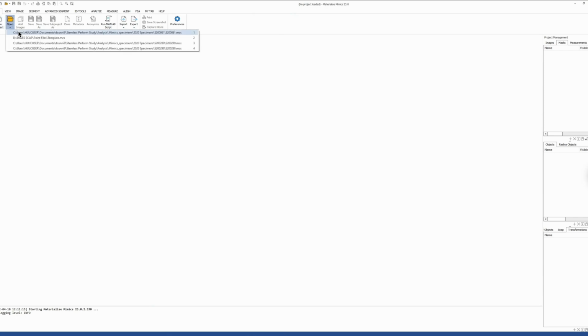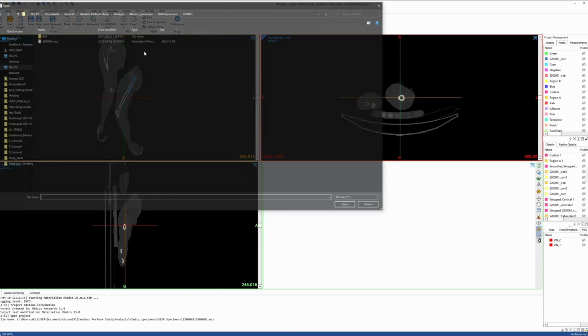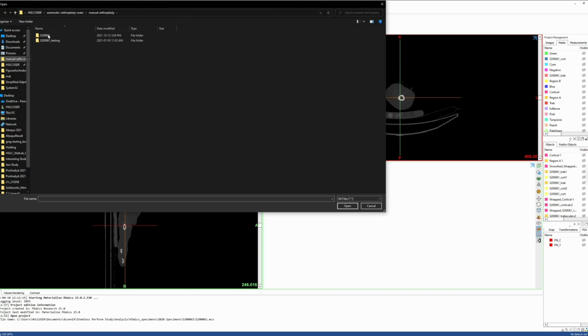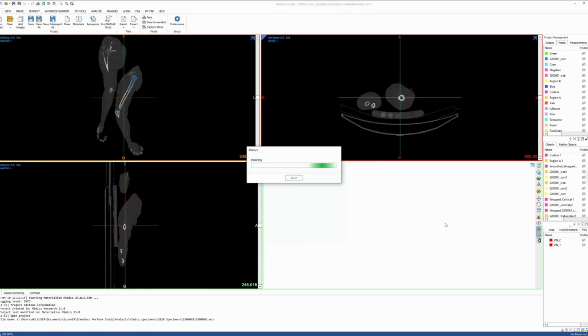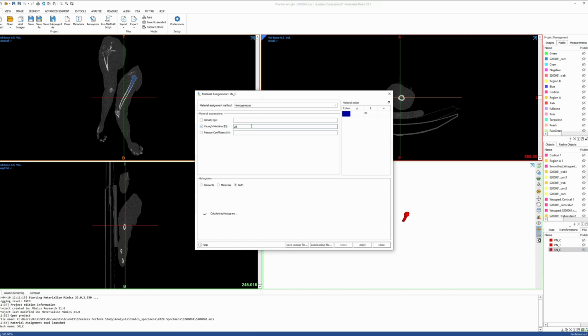Now that we've created meshes for both our cortical and trabecular bone, open up Mimics and the associated patient file. Import your cortical model, and we'll apply that material property first. Once your cortical model has been successfully imported, open up the Material Application screen. Here we're going to apply homogeneous material properties with a Young's modulus of a static 20,000 megapascals and a Poisson ratio of 0.3.